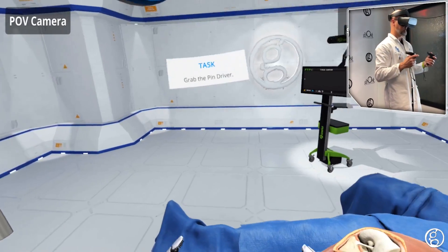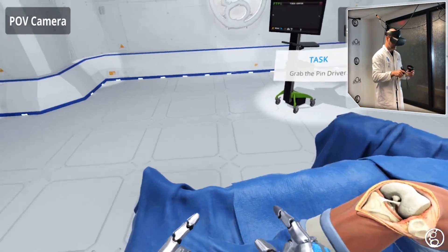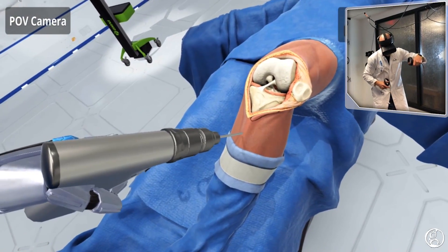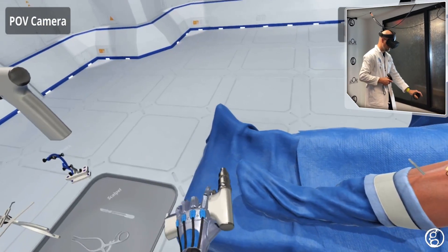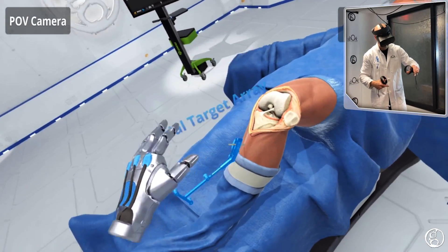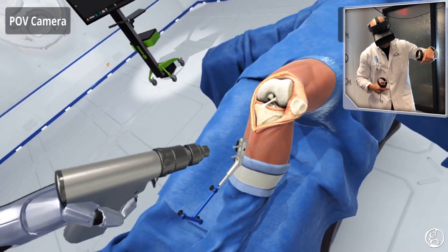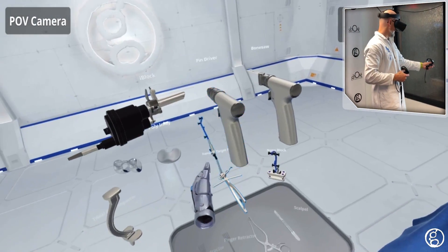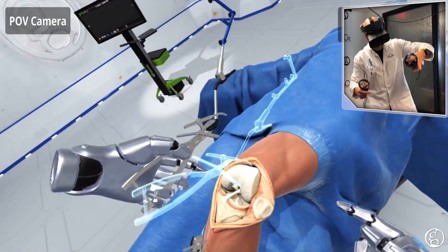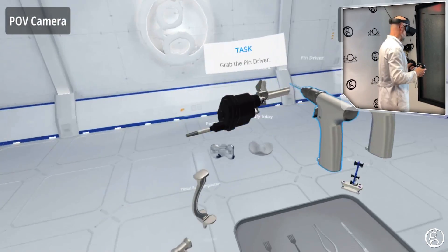Now we're up to using some of the omnibotics tooling. The first thing we're going to do is put a cortical pin about four finger widths down from the tibial tuberosity. I'll use this pin driver that already has a pin installed. Now I can grab the tibial array — you can see it's shaped like a T. I can put that on the pin, grab the pin driver, and put the second pin in to anchor it. Now I can select the femoral target array — it's got an F — and I can put it on this highlight on the medial side of the knee. It's held there by my virtual assistant while I put these two fixation pins in. I'll walk around to the other side of the patient to do that.